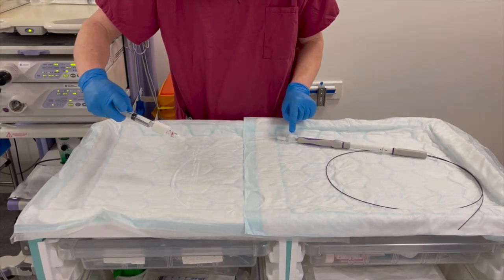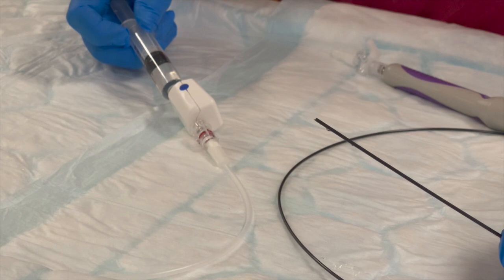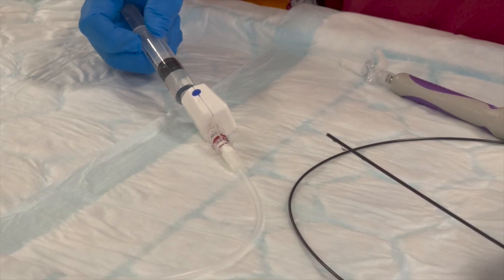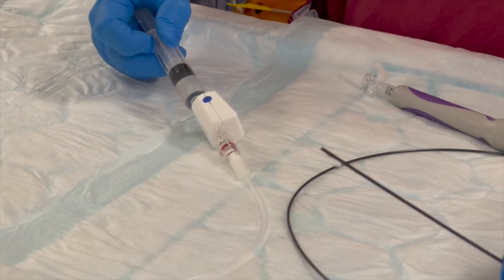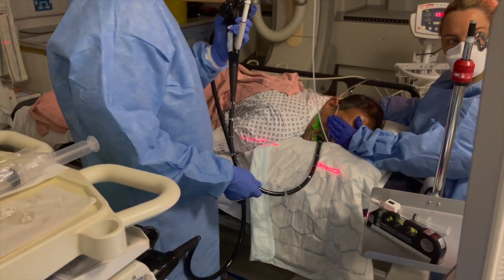You will not usually require more than 10 mils of saline for the entire procedure, including flushing the needle and taking 3 measurements for the hepatic veins and 3 further measurements for a portal vein branch. Use the average of 3 readings for each vessel. Consider how you might standardize the placement of your pressure transducer, which is a critical step.